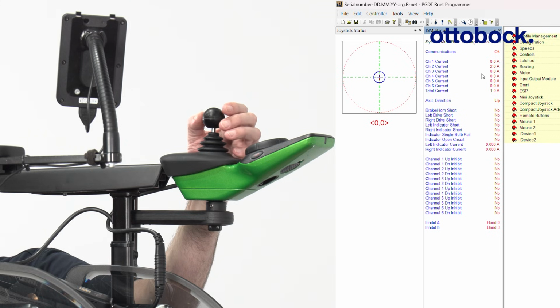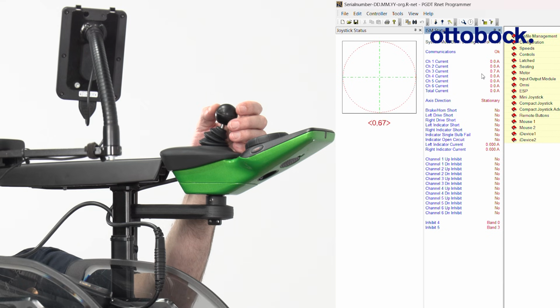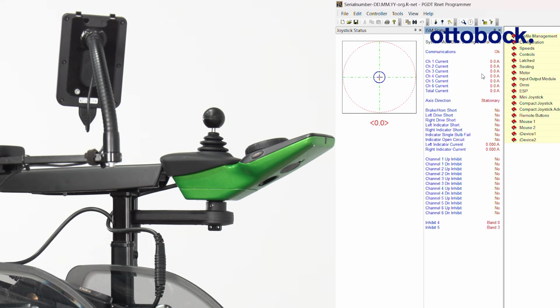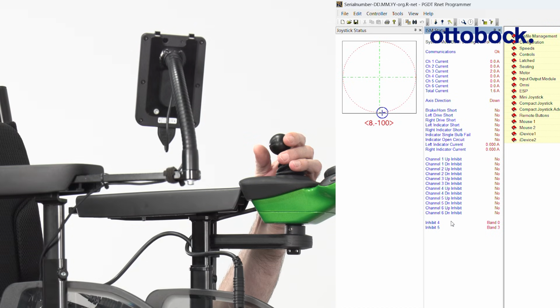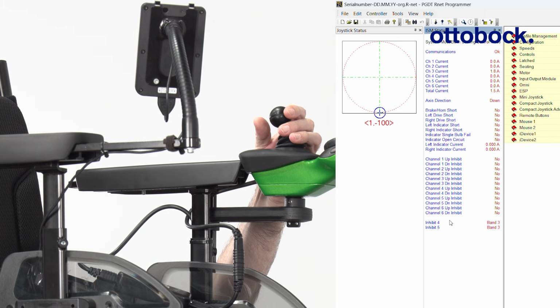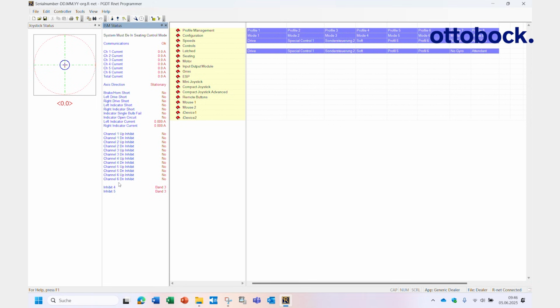In Ottobock wheelchairs, inhibit 4 limits the wheelchair speed when the lift is extended. The reduction in speed ensures safe operation. Inhibit 4 switches between the states 0 and 3. 0 means the wheelchair can drive at full speed, while 3 indicates that the speed is reduced. If the state does not change, the limit switch that detects the lift, or its wiring, may be defective.